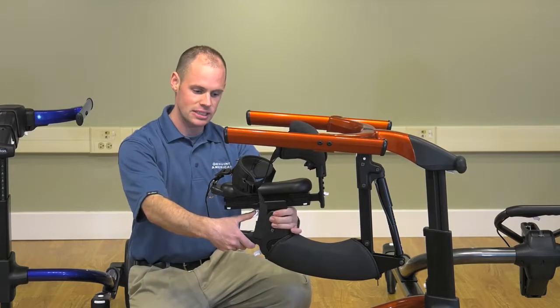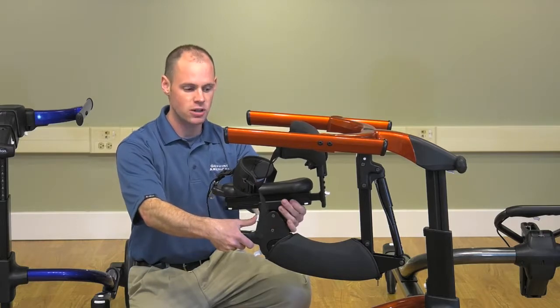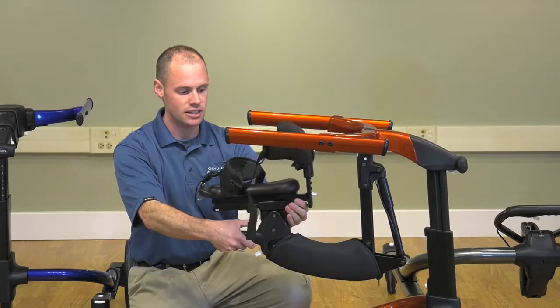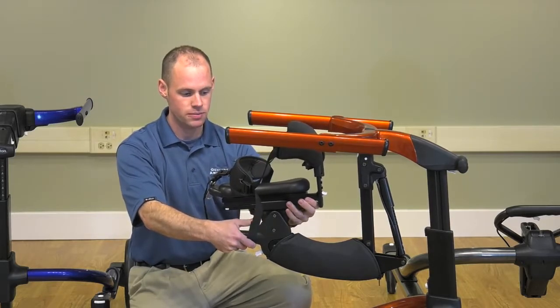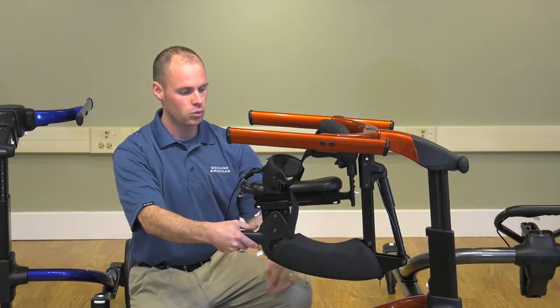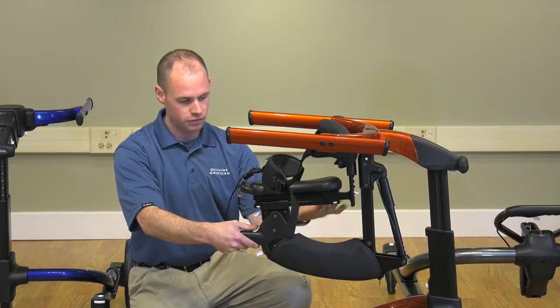Next, we have this lever under the seat, which allows for seat position. So it allows the seat to slide through a range of positions with about 6 inches of play.